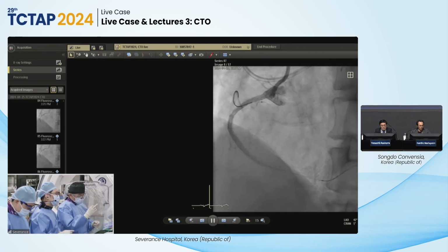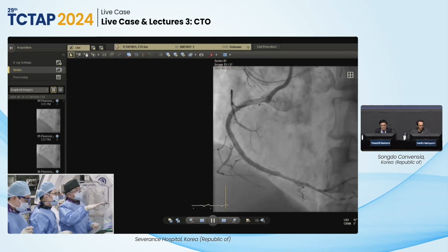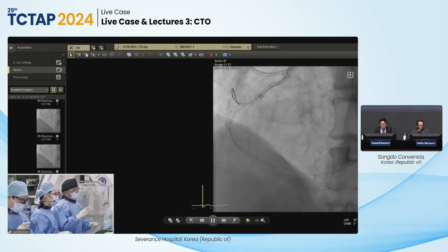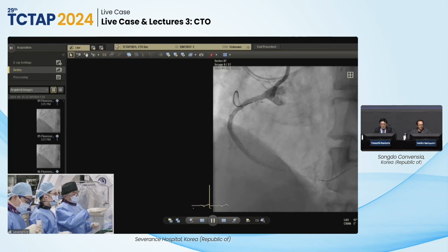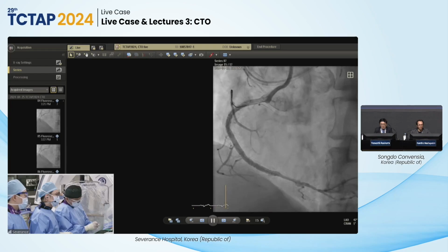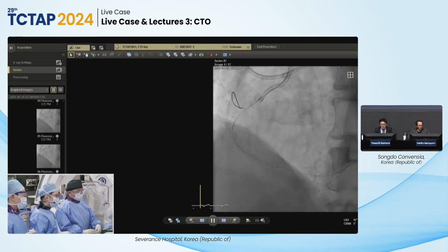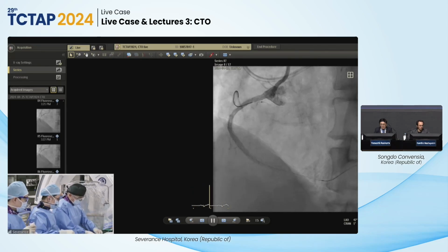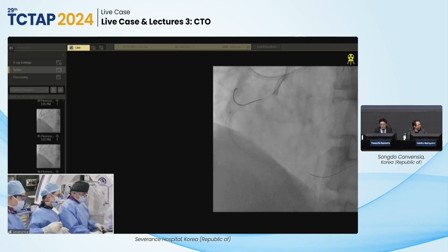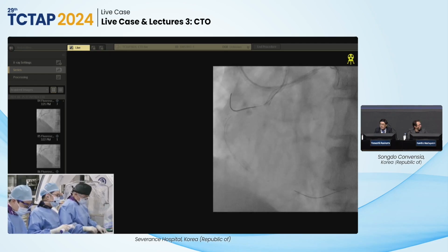Yeah. But from the pre-procedure IVUS images, we already know that some diseased portions were noted in the distal RCA. So sometimes a balloon is helpful, but what do you think in this situation? Do you always perform the balloon or not? Yeah, so if there's plaque there, honestly, we do a lot of drug-eluting balloon there nowadays. Okay. Yeah, a couple of comments. If it's soft plaque, Simon, it works perfectly. I don't know if it also works with a normal conventional balloon, but DCB works.